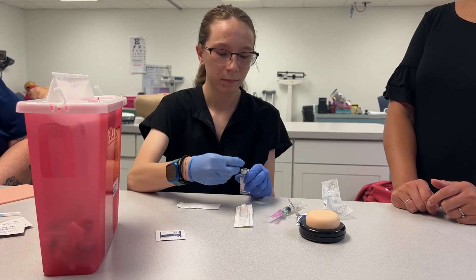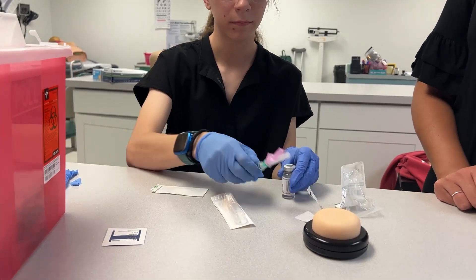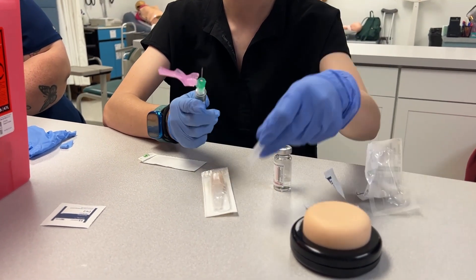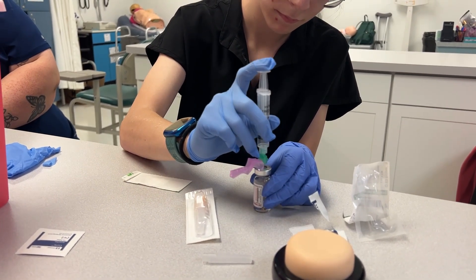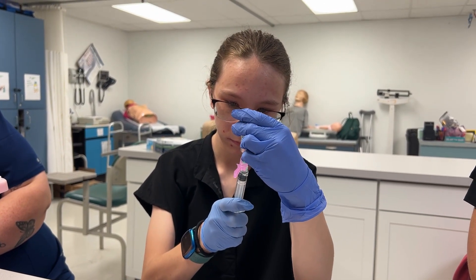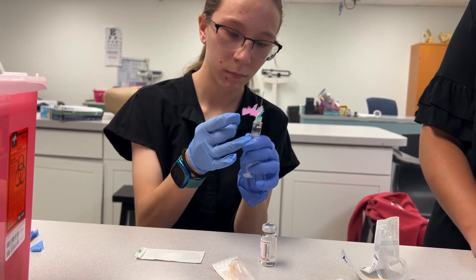Typically when you draw medication up like this, we don't want to use the same needle to give to the patient, because we can blunt the tip of the needle and it won't be as sharp. So we want to switch needles. Go ahead and draw your medicine up. Go ahead and try to get your bubbles out of there.